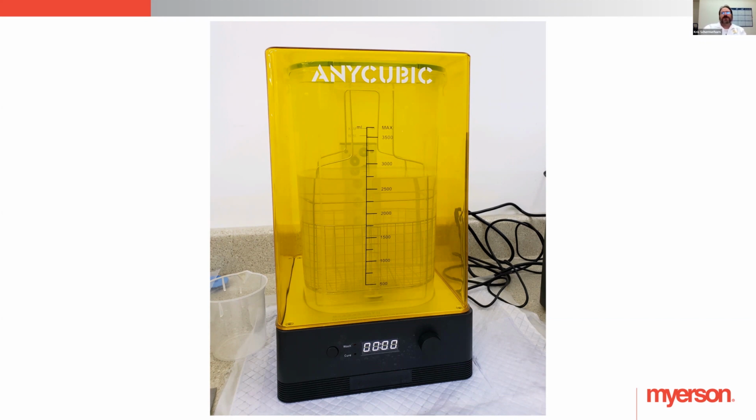And he said, if you can imagine when you place an appliance in alcohol, the alcohol eats away dramatically at the stucco of the house. This is an analogy. It starts to eat through the board that the stucco is stuck on, and some of it gets into the frame of your house. And so what that does is it can dramatically weaken your appliance. So the less time that material spends in alcohol, the stronger appliance you're going to have.